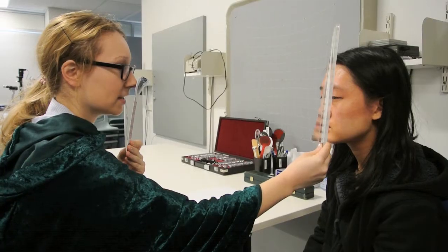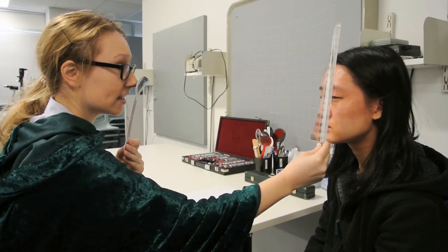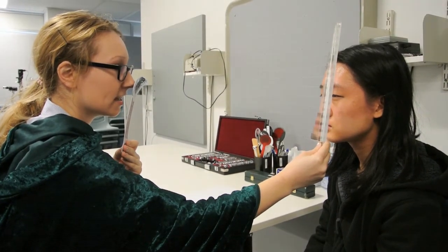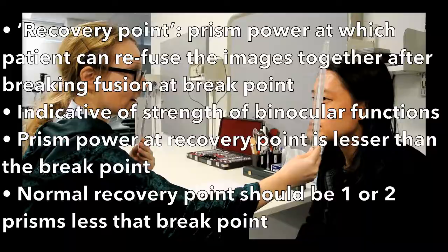Still single? It's double. The patient has indicated break at 16 diopters — this is when the patient can no longer fuse the images together. The next prism strength is shown, and if still cannot fuse images, go back to the previous one. However, if the patient can fuse the next one with some effort, continue to push for more to get the full extent of their fusion range. Can you try and make it single? No. Tell me when it's single again. It's single. The patient has indicated recovery at 14 diopters — this is when the patient can just fuse the images together.